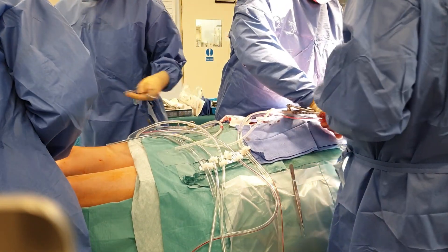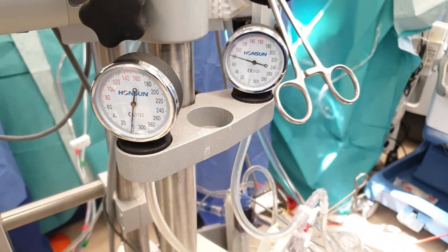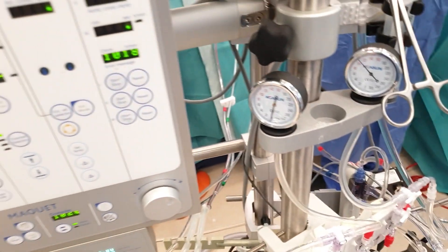Putting a patient on cardiopulmonary bypass provides a bloodless field for the cardiac surgeon to operate on. A team effort between the surgeon, perfusionist, and anesthesiologist is paramount for the successful completion of cardiopulmonary bypass.